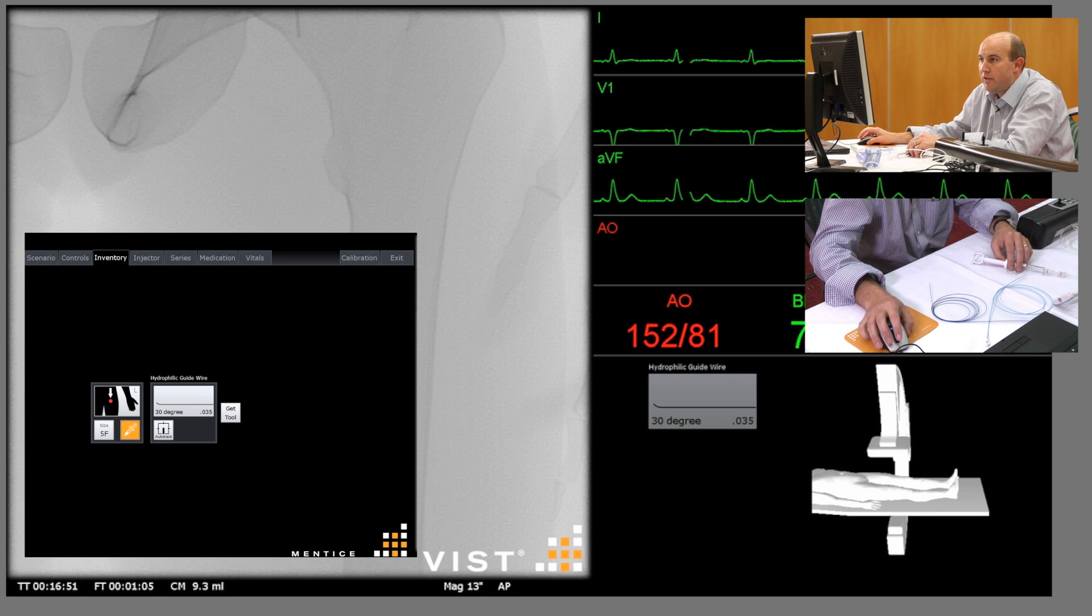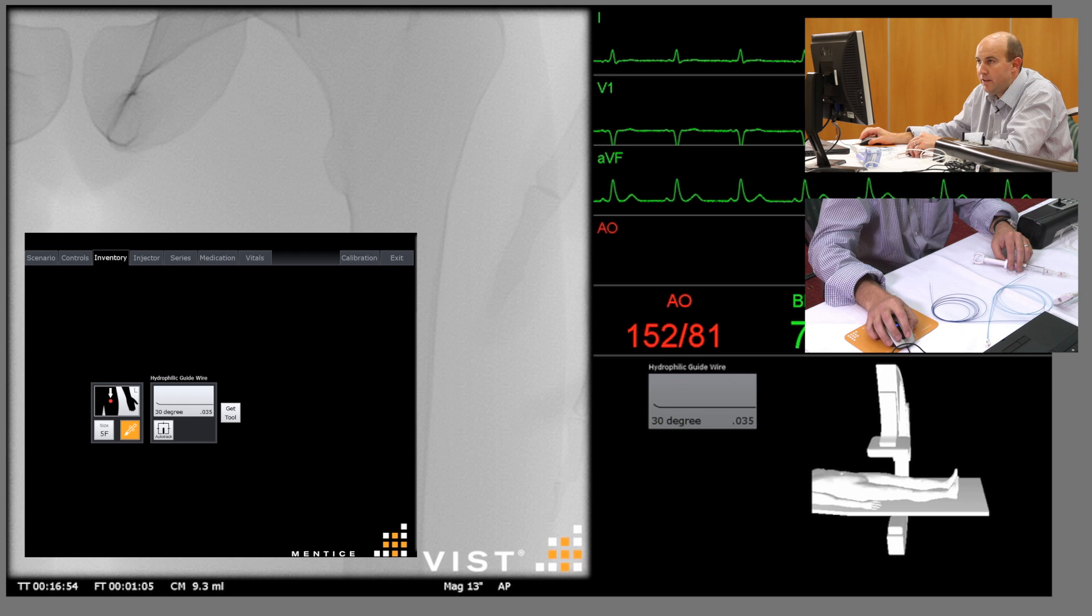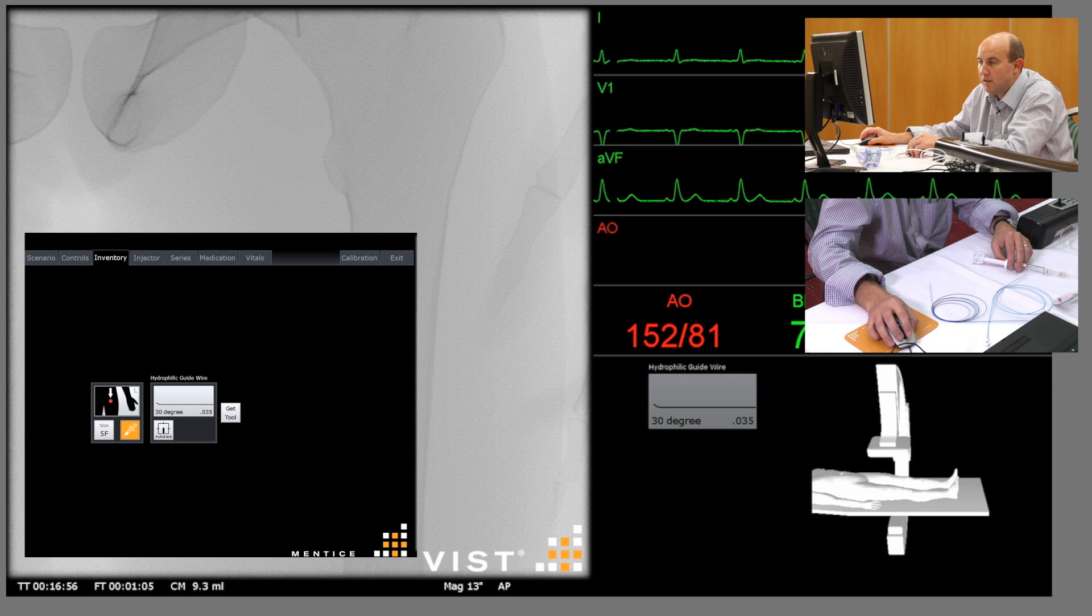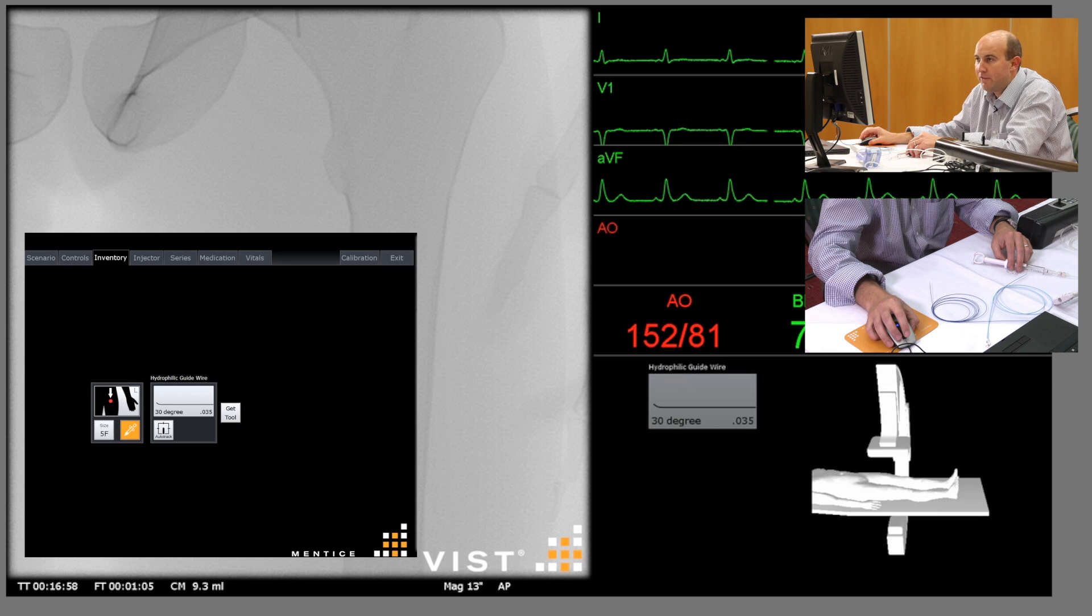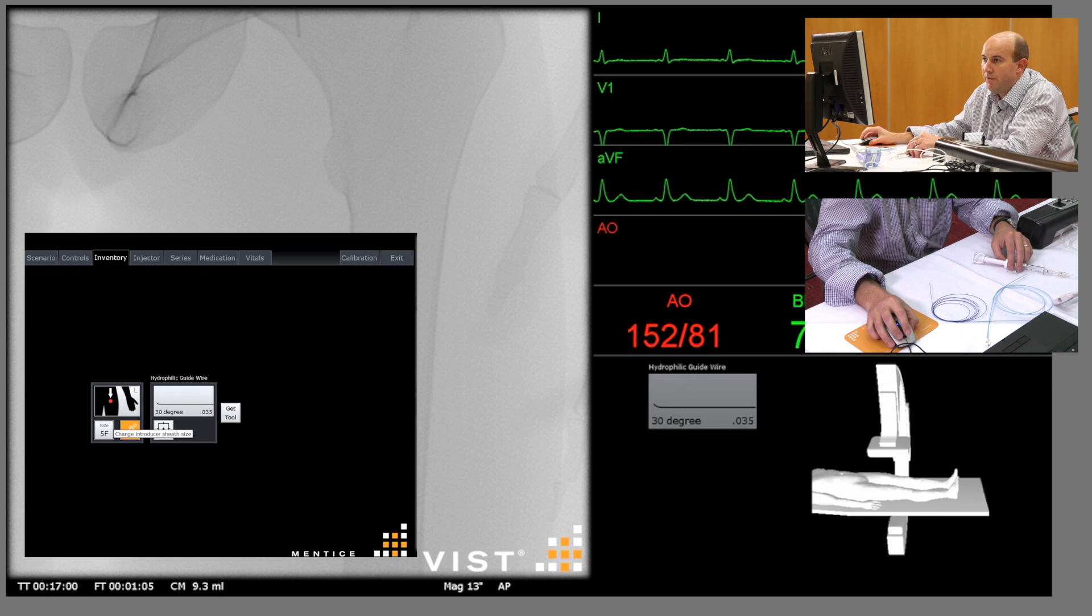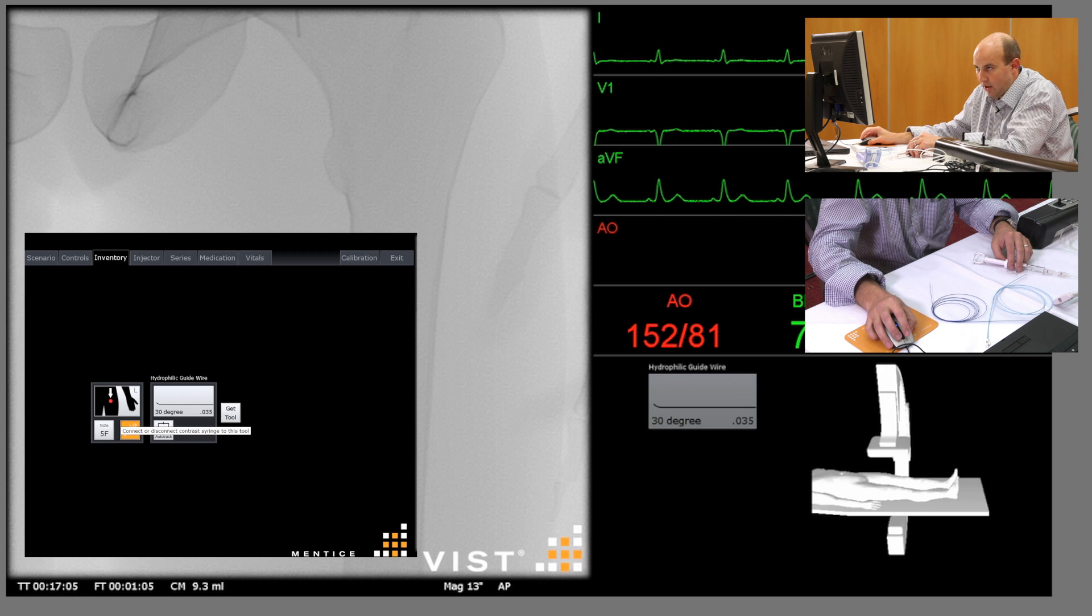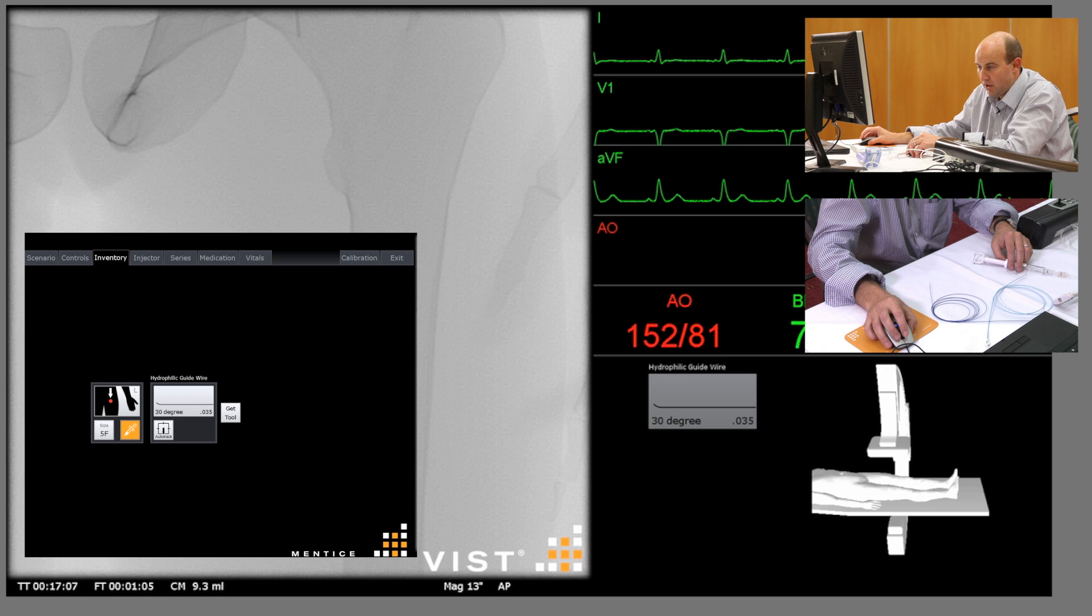The arrow pointing to the left common femoral artery, we have a five French sheath pre-selected, and we also have an injector contrast injector selected so that we can do our diagnostic runs through that sheath.